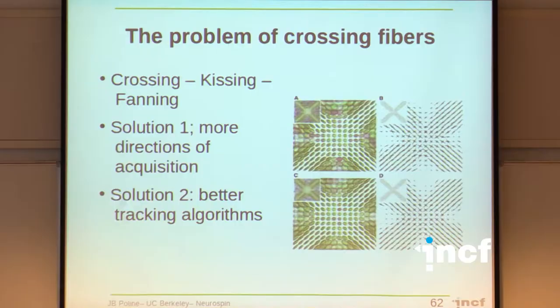The solution is to increase the resolution, both spatially, with smaller voxels, and in the angular direction, measuring more directions, and to use better tracking algorithms.